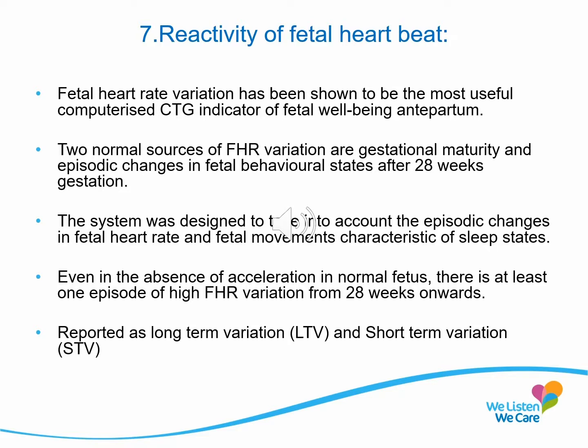The system was designed to take into account the episodic changes in fetal heart rate and fetal movements characteristic of sleep states. Even in the absence of acceleration in a normal fetus, there is at least one episode of high fetal heart variation from 28 weeks onwards. This is reported as long-term variation and short-term variation in the computerized CTG.